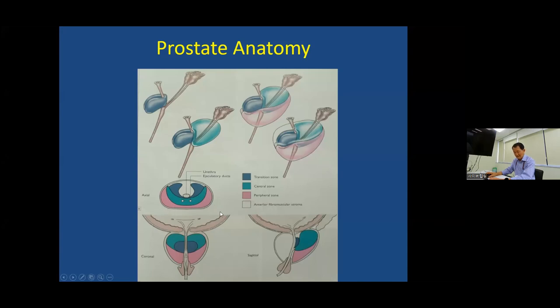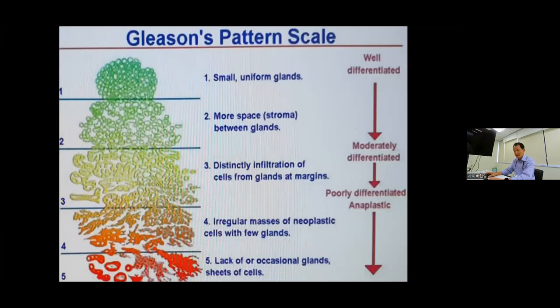This is transaxial images, this is coronal, and this is sagittal, of course. This peripheral zone here is the area we are looking at carefully. Obviously, after pathologists do a biopsy, they make a Gleason score, 0 to 10. Above 7, 8, 9 is very high risk. Below 7 is a benign type, so it's just watching. But 7, we have to study hard. 9, 10 usually show extracapsular spread of prostate cancer.